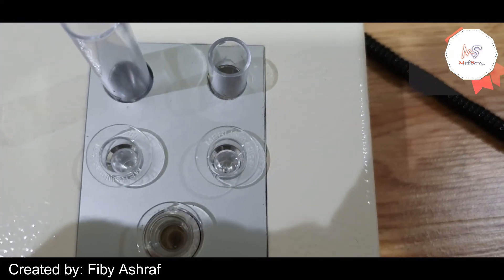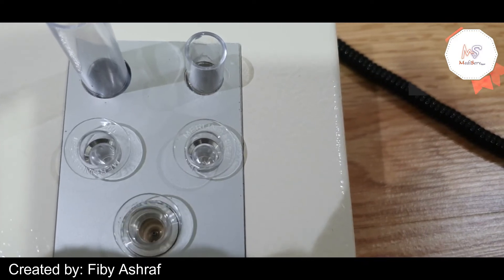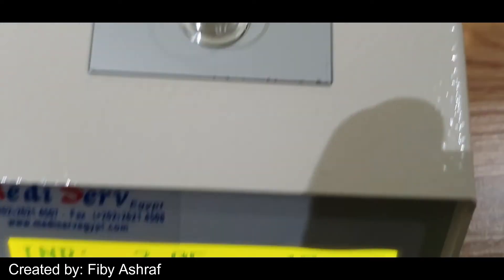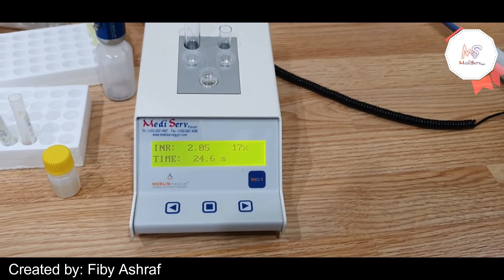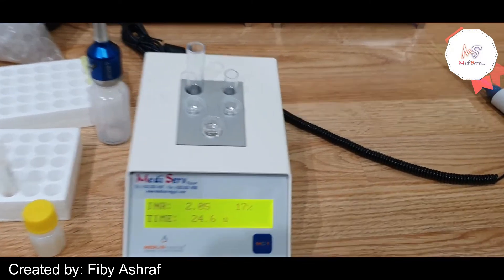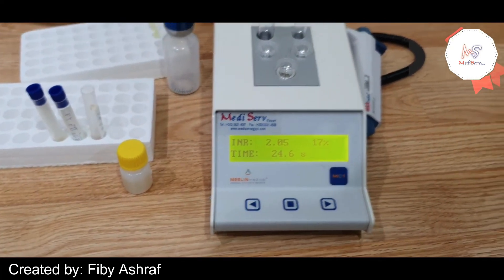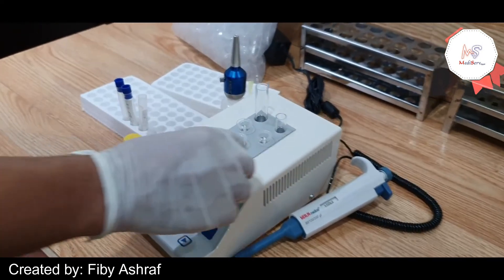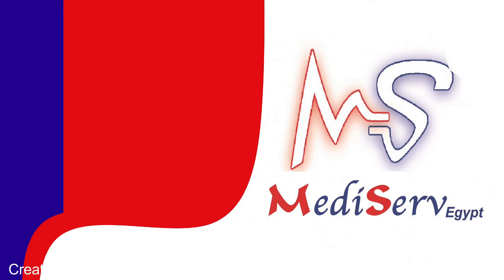When the clot begins to be formed, it leaves its place and rotates with the cuvette, giving indication of the end of the measuring process. The result then appears on screen in seconds, as a percentage, an INR, or any pre-set unit. Thank you.